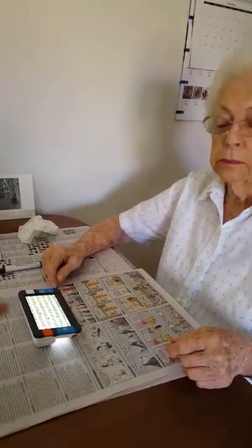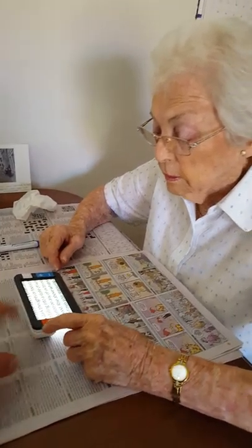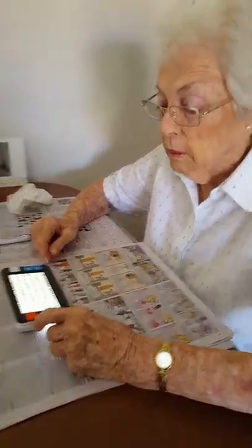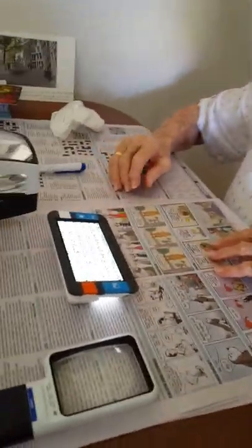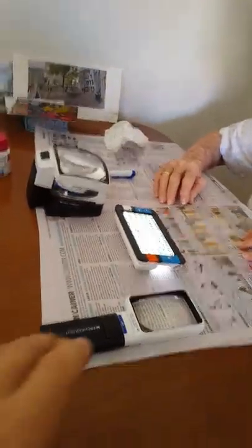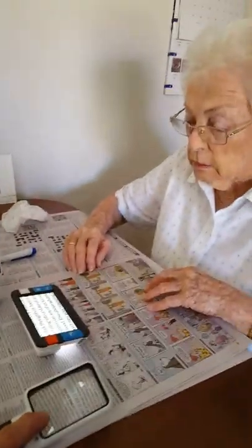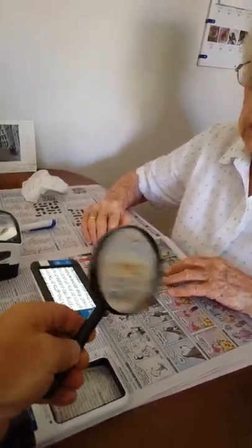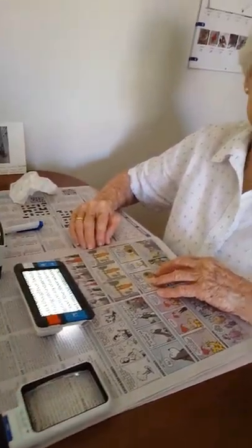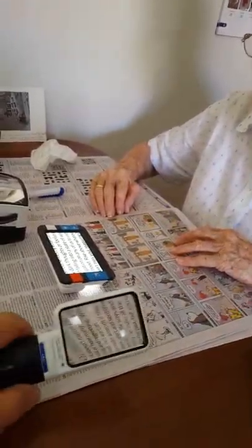So now what we're going to look at is the Compact Plus HD, which is this one here. This machine, you're finding, Peggy, is better than the magnifying glasses that we've tried you with. The reason being that with those ones, because of the bend in the glass, you're getting quite dizzy with them. You already use very unsuccessfully a two-times magnifier without a light. You did find a benefit from the illuminated magnifiers, but the bend in the optics makes you feel quite dizzy.